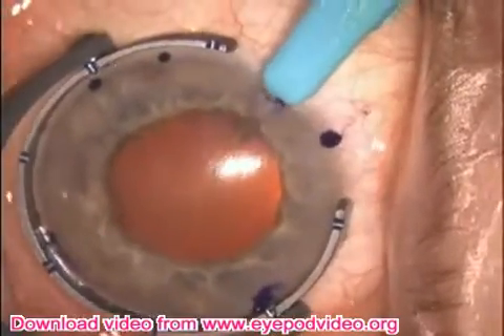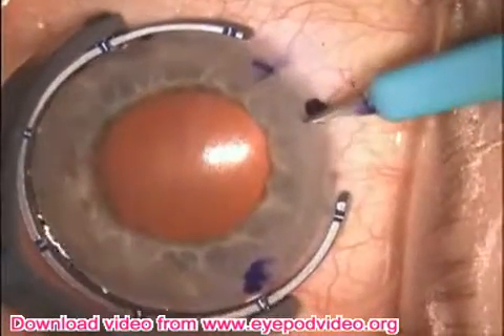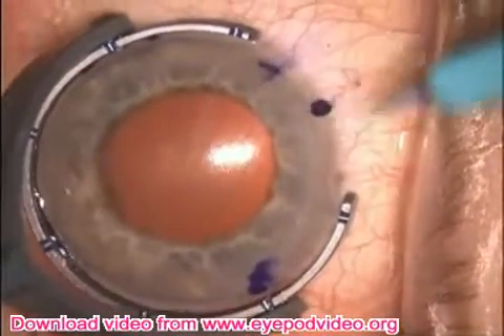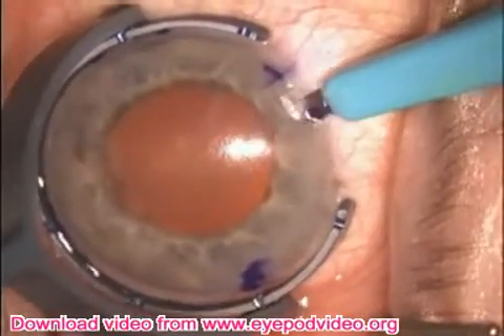Here's the standard paracentesis incision made to the hub. Now we're going to make an incision for one of the retractor hooks. You can see that we enter with the toe down a bit more and make a shorter incision.